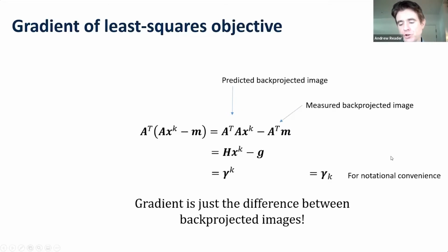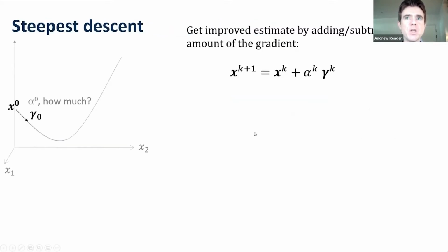Now, of course, the objective function is not always beautifully set out. And so even if we optimize this search direction, it won't directly minimize the objective function. I'll show you a demonstration in a moment, just an illustration of that. First of all, then, just to go for the 2 pixel case here. So imagine I've got pixel value x1, pixel value x2, got some initial estimate, vector x superscript 0. So that would just be a value of 0 and 0 at the origin here.